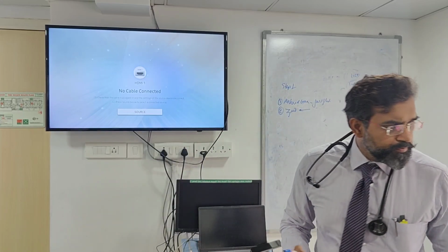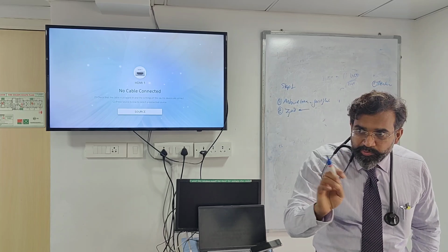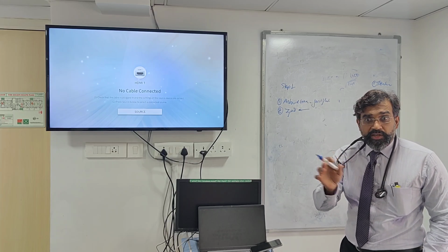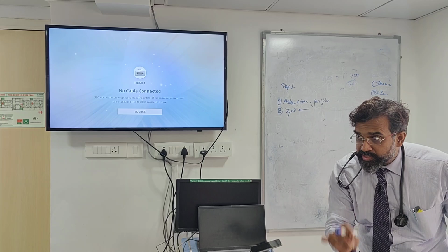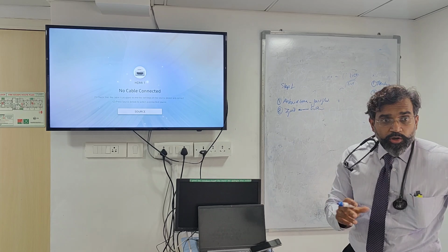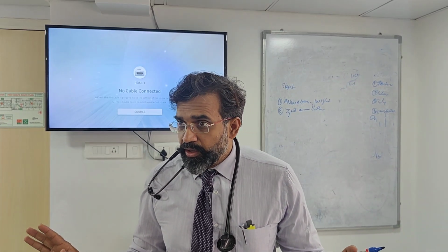Understood? Zeroing can be done at any station, but the zeroing procedure requires leveling. Zero and leveling come together. Whenever you are zeroing, step number 2 is complete only when you have leveled the place. Zeroing always comes with level. Understood? Clear on this now?